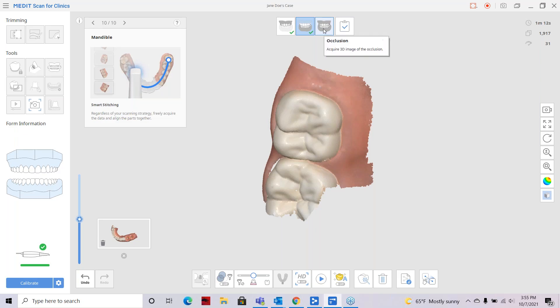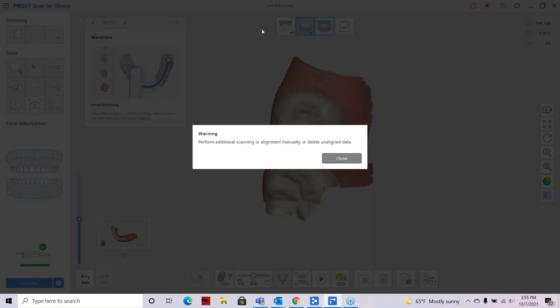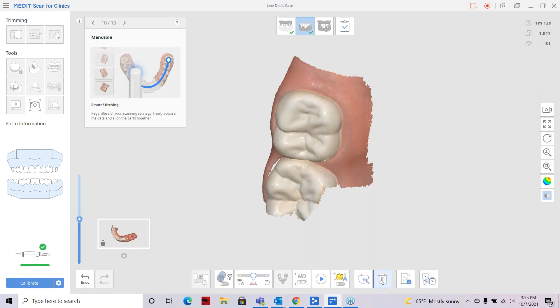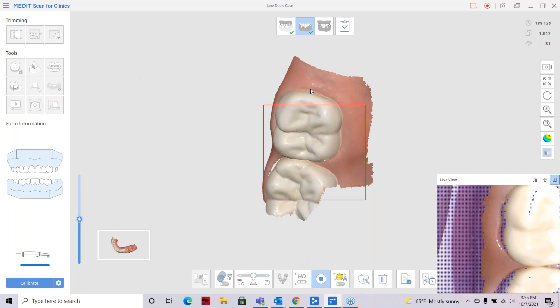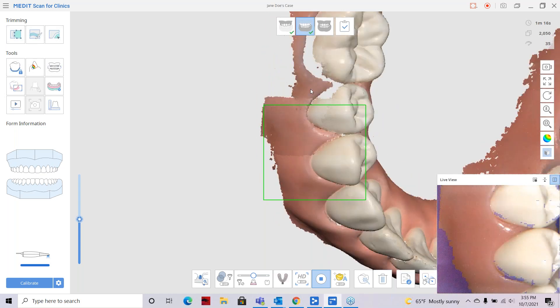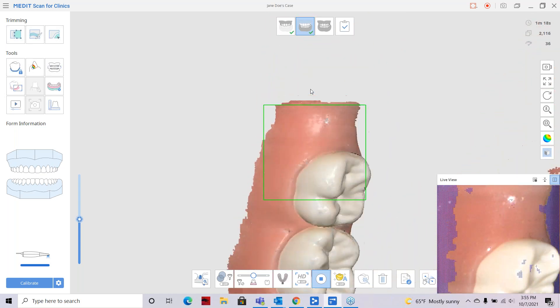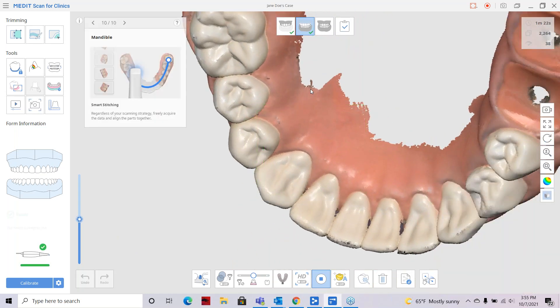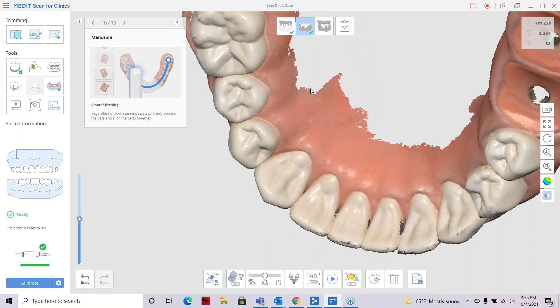If I try to move past this scan stage — for instance, to do the occlusion — it will not allow me to advance until I either delete the thumbnail, delete all of it, or align the data. Let's go ahead and align the data right now. I'll start where I left off and you'll see it marries that information up. It does allow you to skip around while scanning, still producing very high quality scans.